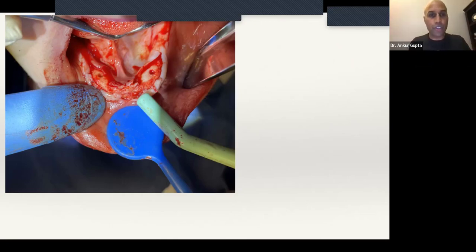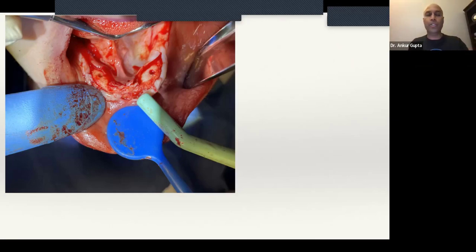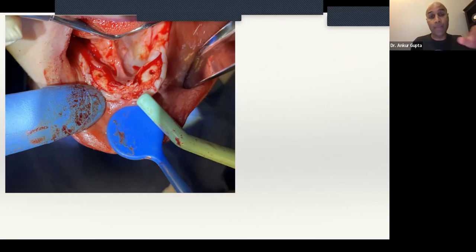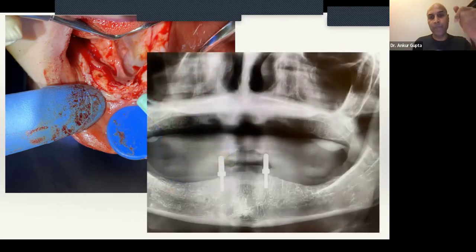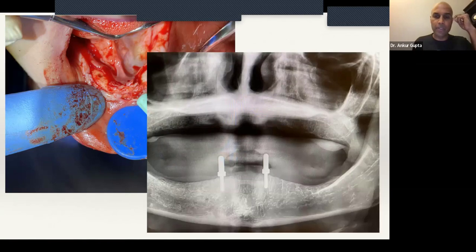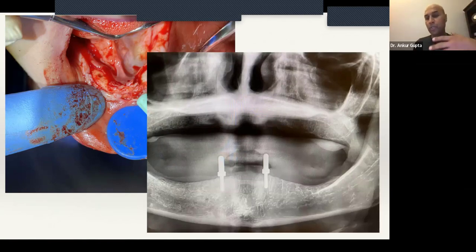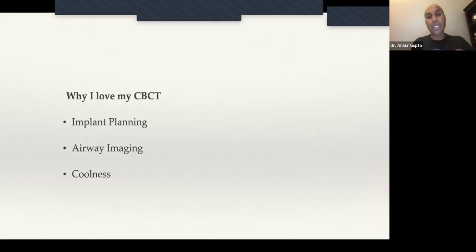The surgical guide will guide me to do it the right way, but the flap will confirm that I'm doing it the right way. So: stabilize your surgical guide, do your pilot drill, maybe do your second set of drills, but then remove the whole thing, lay a flap, and make sure those holes are within bone. In this case, she had some pretty thick bone, so there was room for error. I like where those two implants are — this case is going to restore beautifully. Even though there's some rocking expected with two implants, they're pretty far away from each other. She's going to be really happy.